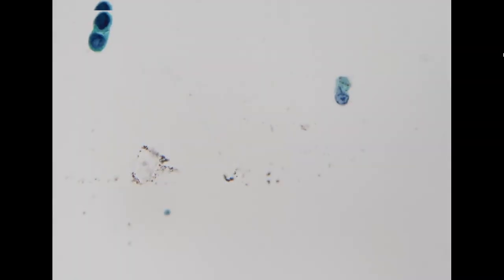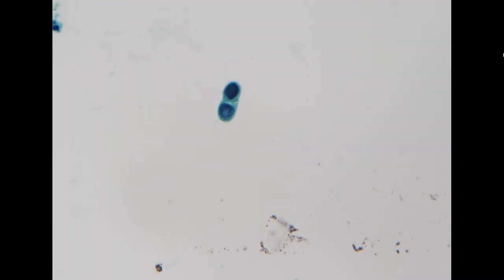Because it's an opportunistic infection, usually you would expect to see more than one cell. For this cluster, it's more hyperchromatic. But when you go to higher power, unlike high-grade urothelial carcinoma, the chromatin pattern is totally smudged instead of coarse chromatin. So it's ground glass, a very homogeneous and smudged pattern.